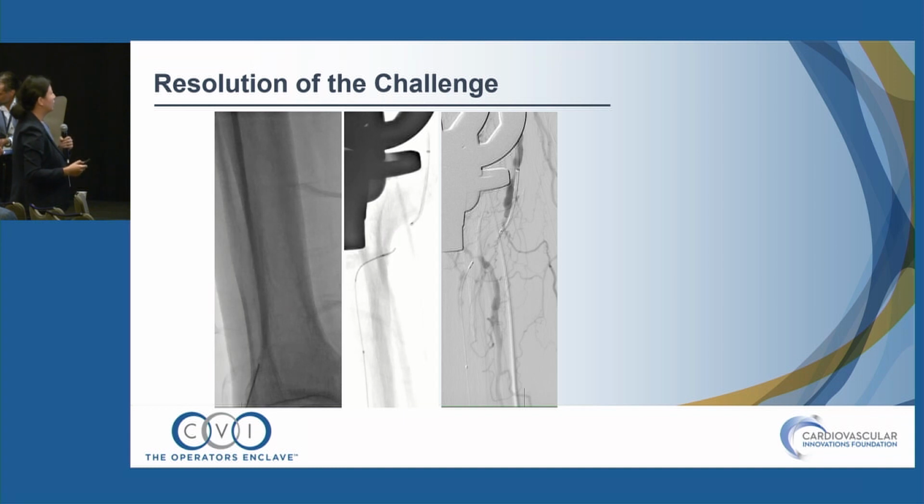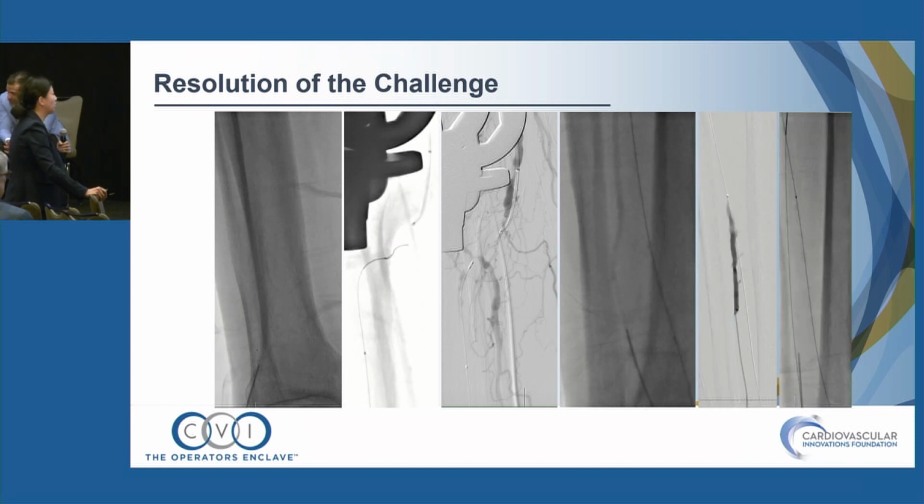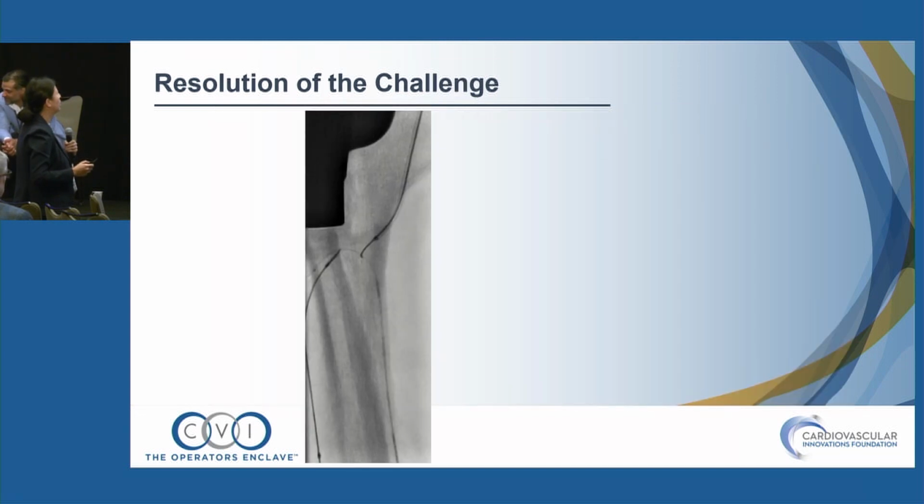So I decided then to get into the peroneal artery. I traditionally still use fluoroscopic guidance for peroneal. We accessed the vein first, so I left the wire in the vein and punctured around the wire. I did an angiogram just to confirm my arterial stick is right where I anticipated it to be. We were fortunately able to get into the peroneal artery, but the wire kept traveling, ironically, into the anterior tibial artery.